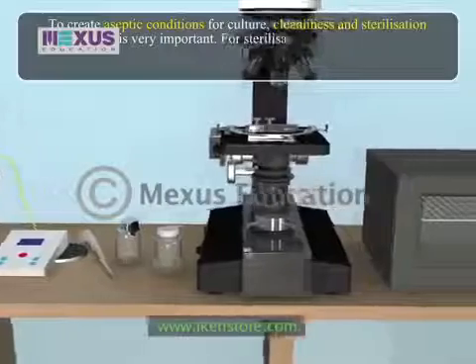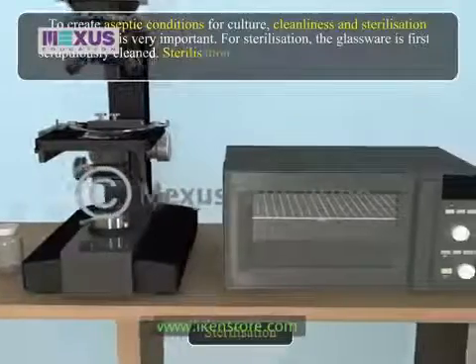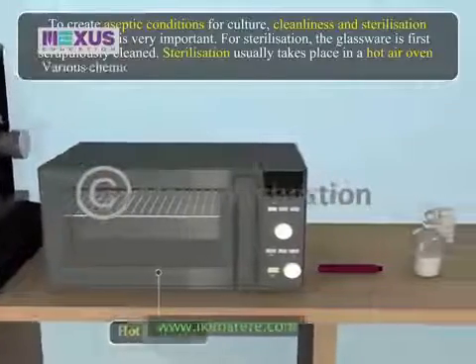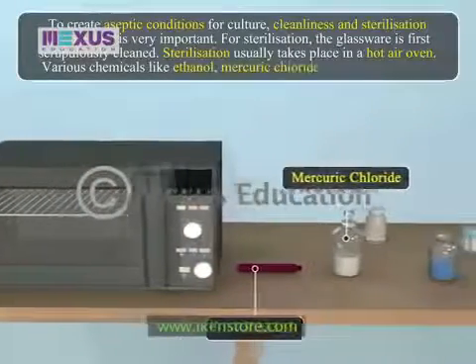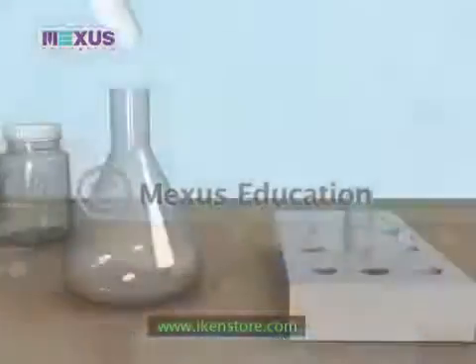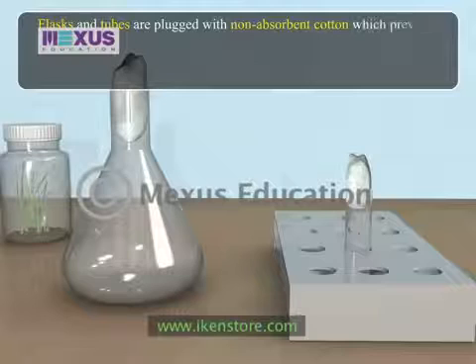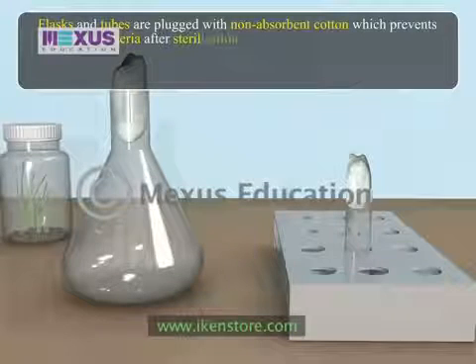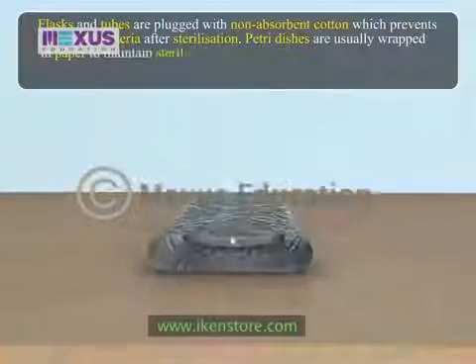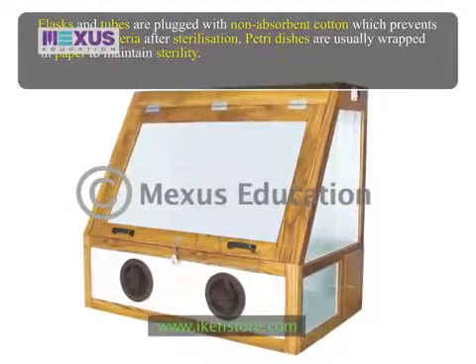For sterilization, the glassware is first scrupulously cleaned. Sterilization usually takes place in a hot air oven. Various chemicals like ethanol, mercuric chloride and cresol are used for this purpose. Flasks and tubes are plugged with non-absorbent cotton, which prevents entry of bacteria after sterilization. Petri dishes are usually wrapped in paper to maintain sterility. The inoculation chamber is usually sterilized by ultraviolet rays.